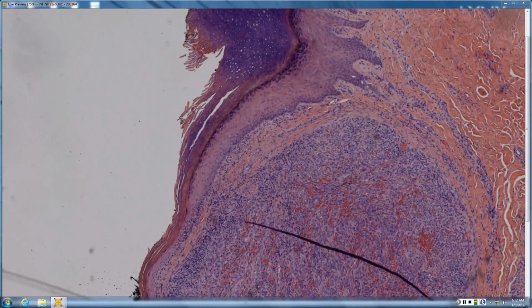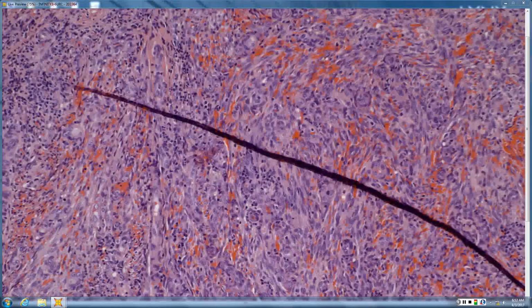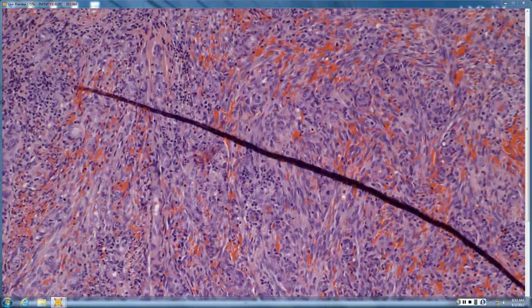And then in terms of getting to Kaposi's, Kaposi's goes through all the different phases, the patch and plaque and nodular, and by the time you get to nodular, it's usually a little bit more on the spindle cell side and a little less on those tiny little kind of slit-like vessels and promontory sign and all that other stuff that we learn about. And they can be pretty dense. And so here, it's really more dense than anything else, this kind of dense spindle cell proliferation.